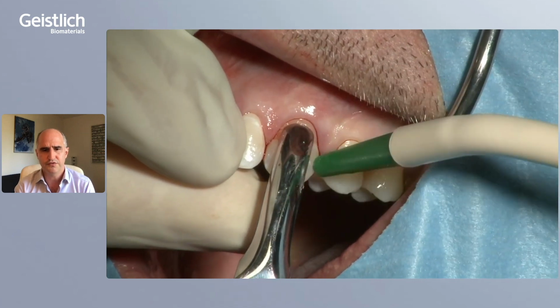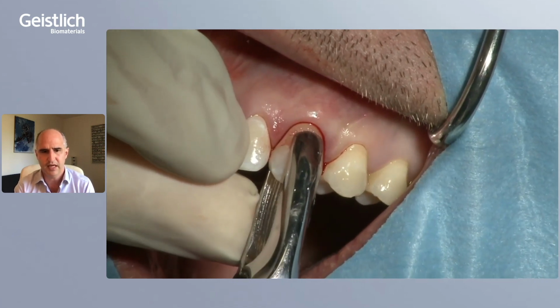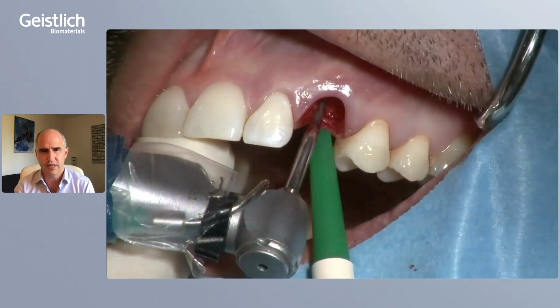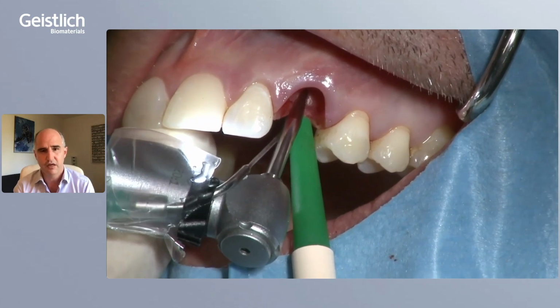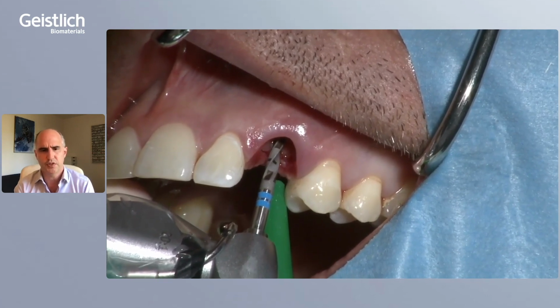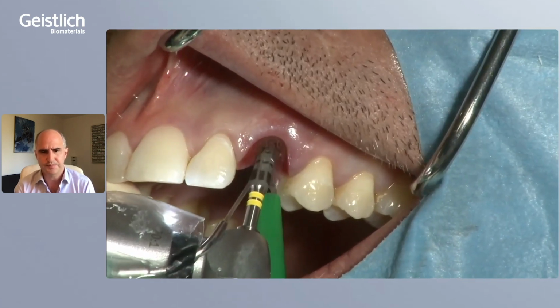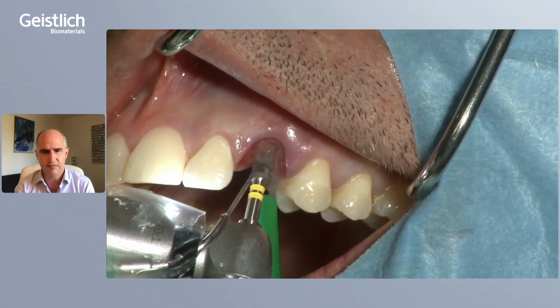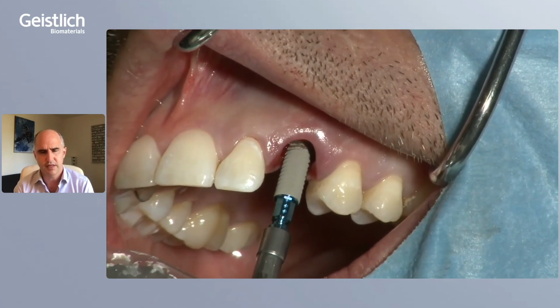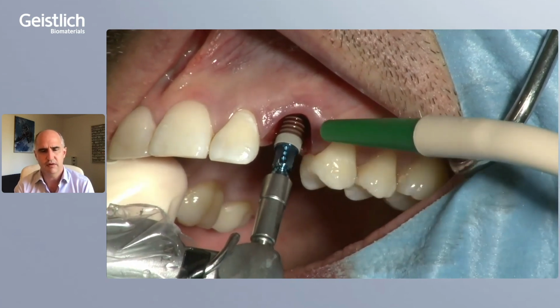So we removed the tooth without clinching into the papillae and causing trauma to the papillae. Then we evaluated the buccal bone plate. We had an intact but thin buccal bone plate, so of course we were thinking of grafting this gap between the implant and the buccal bone plate. Then we did the pre-drilling. In this case, as you see here, in a palatal position, like Buser has shown us, with a flapless implant placement, and then we placed the bone level implant into the housing, as you see here, in a palatal position.